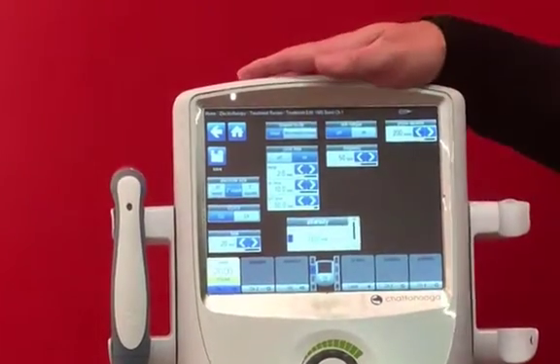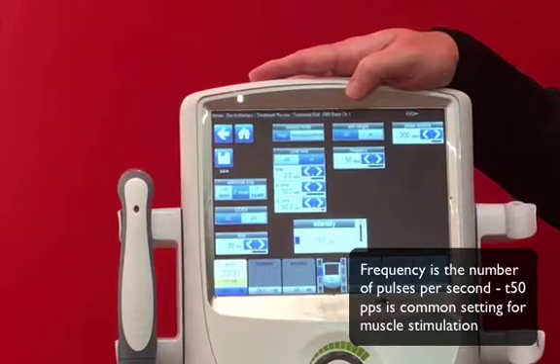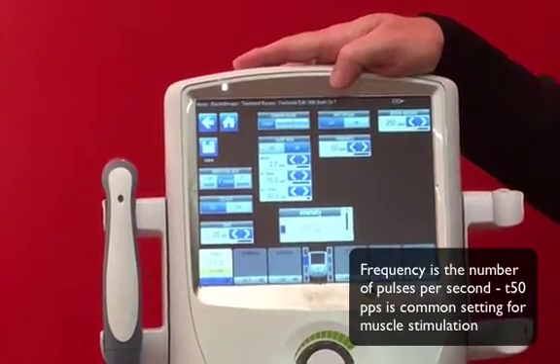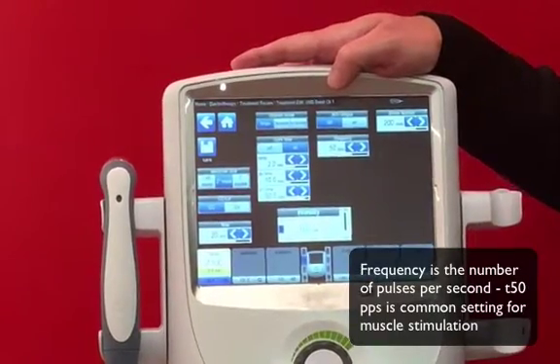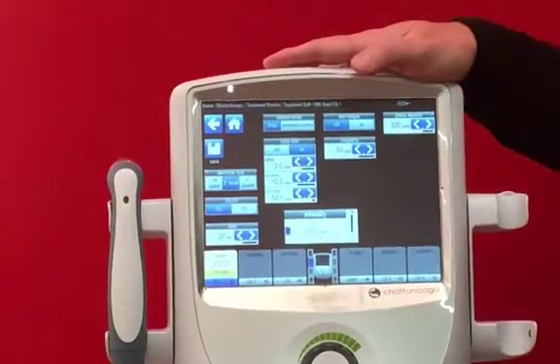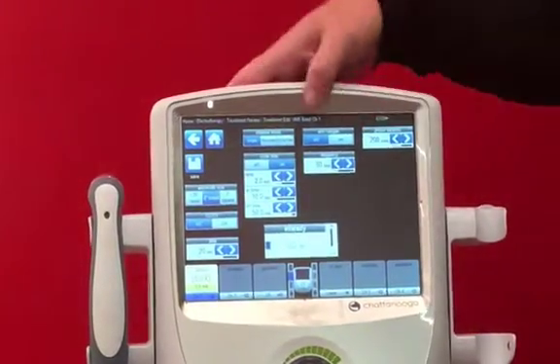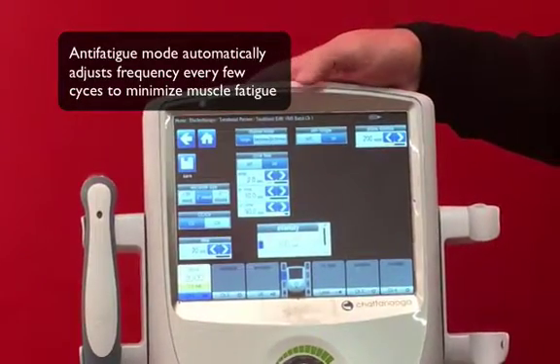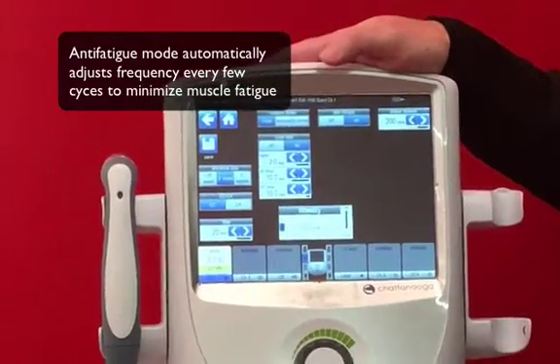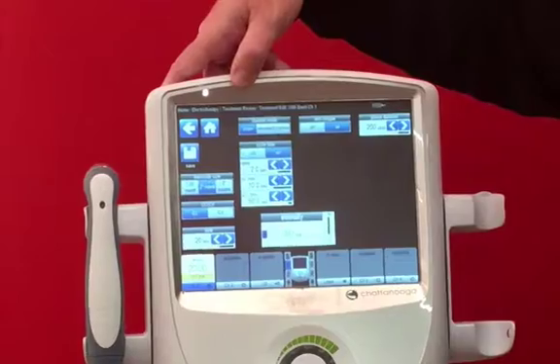We also have the duty cycle or frequency — this is a burst duty cycle representing the number of pulses per second. It defaults to 50 because that's a very commonly utilized frequency to maximize motor unit recruitment for muscle tissue. We can increase or decrease it as needed. There's also an anti-fatigue setting that helps determine whether the current will be increased or decreased depending on how the patient is responding.